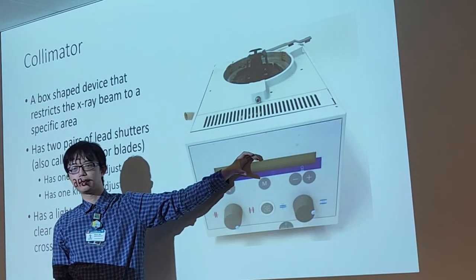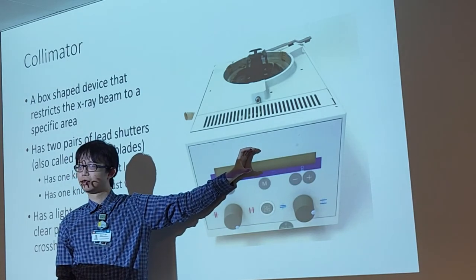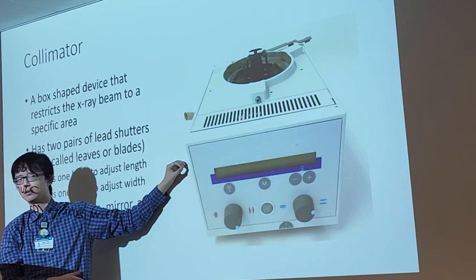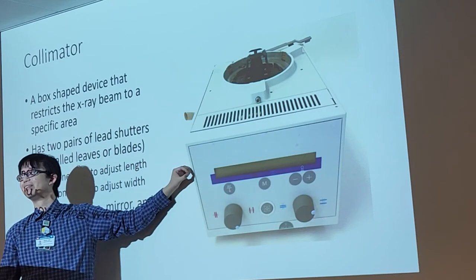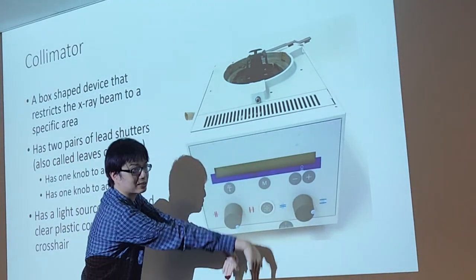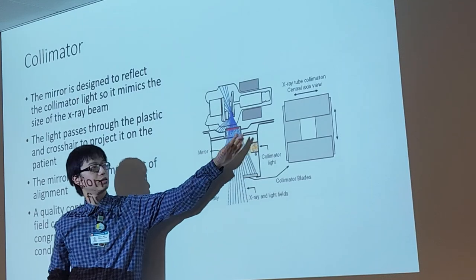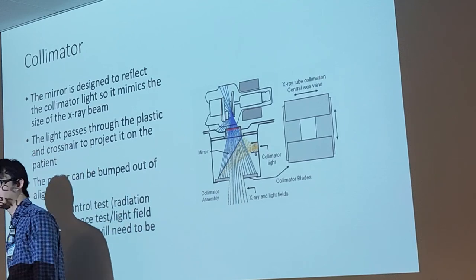So how do we take a picture without having a light bulb in the middle of a patient's chest? Well, if you take the light bulb, then we move it over here to the side. So now the X-rays can pass through without shooting through the light bulb, right? But if the light bulb's over here, how does the light come down here? With a mirror! Very good. You put a mirror right here, so the light bounces this way, and then it bounces that way. So the light bulb's on the side. Here's the light bulb, here's the mirror. So the light bulb shines the light this way and then it bounces down the collimator.